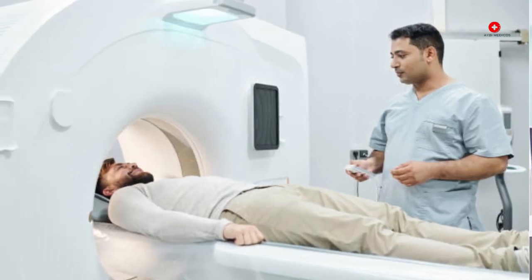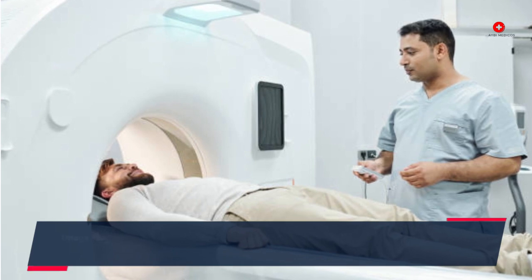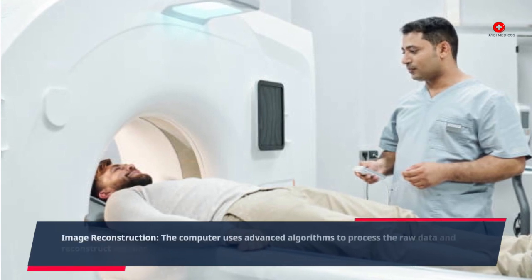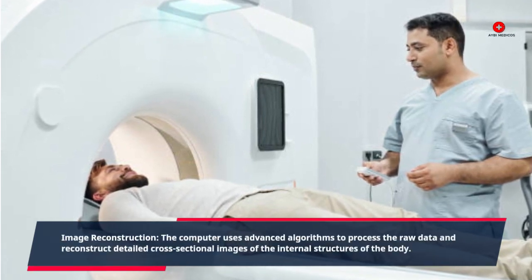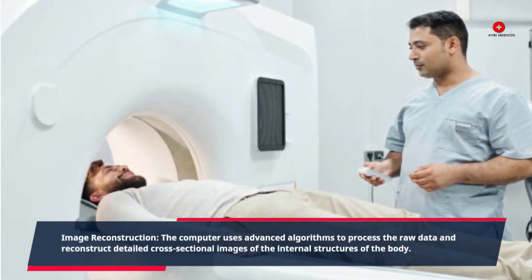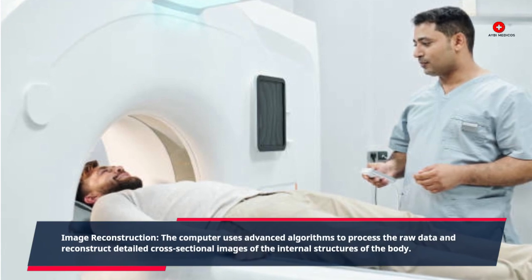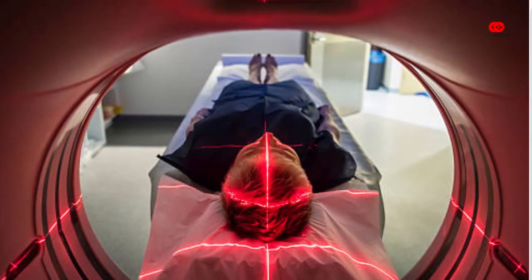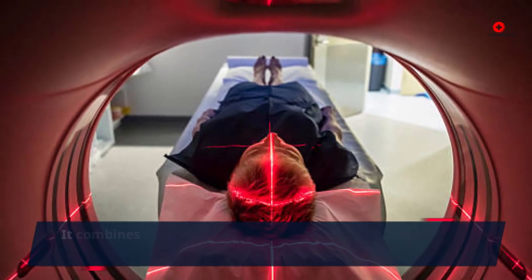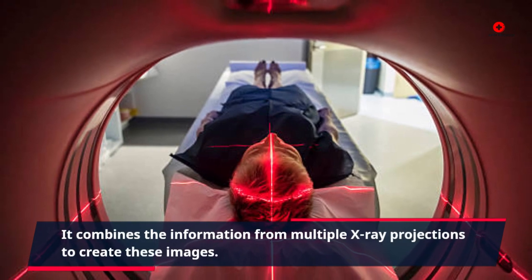Image reconstruction: the computer uses advanced algorithms to process the raw data and reconstruct detailed cross-sectional images of the internal structures of the body. It combines the information from multiple x-ray projections to create these images.